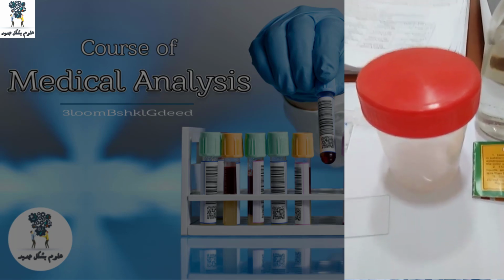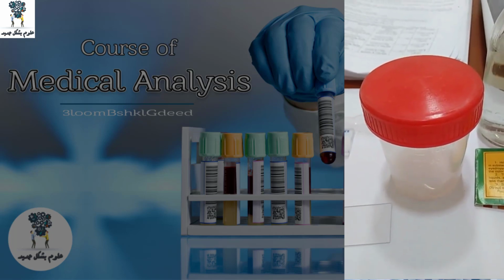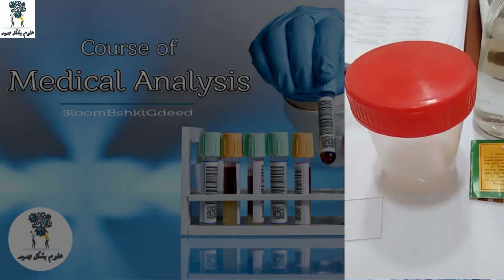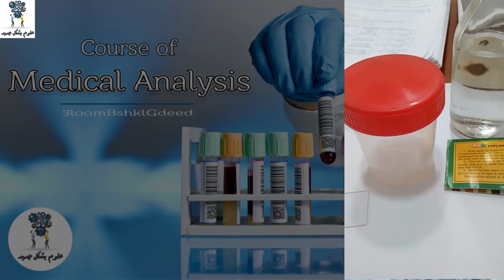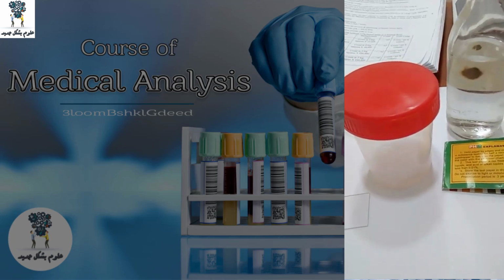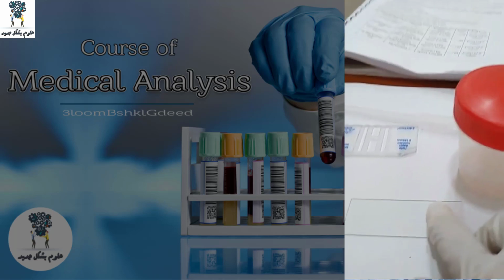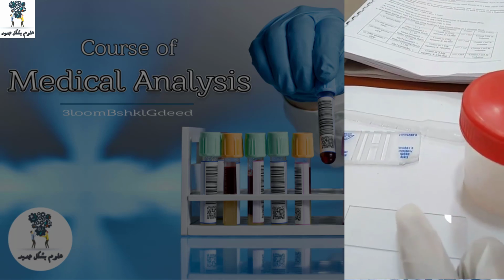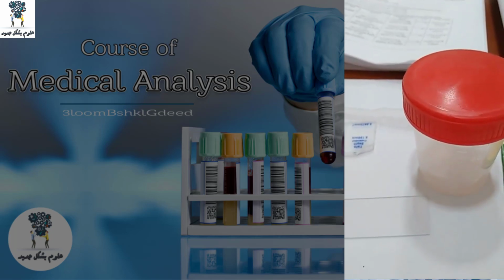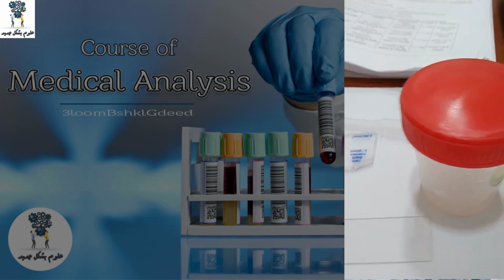There are no sperms, really there are no sperms, but after a moment we will discover it, and then we check it again and again, we find 1 sperm. So we will multiply by 10,000. There is another case when we check under the microscope, you take 10 microliter on this slide, and you can find nothing. And then you discover 3 sperms.